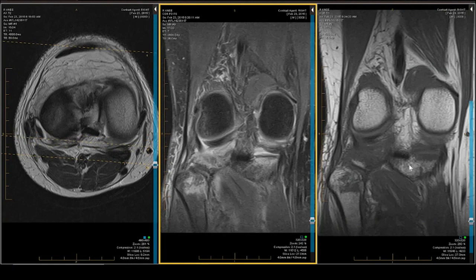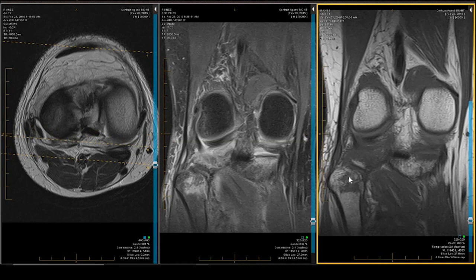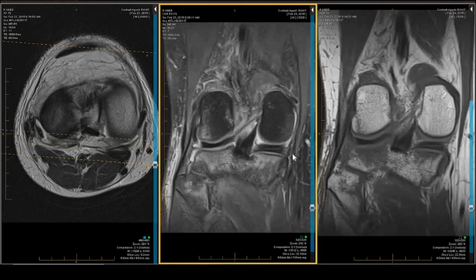Because this patient had a twist rather than a varus or valgus injury, we have to be worried about the corners. That also explains why there is a fibular head comminuted fracture, which tells us more about the mechanism of injury and should heighten our concern about the corners.